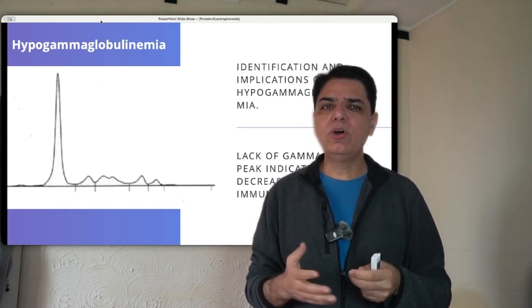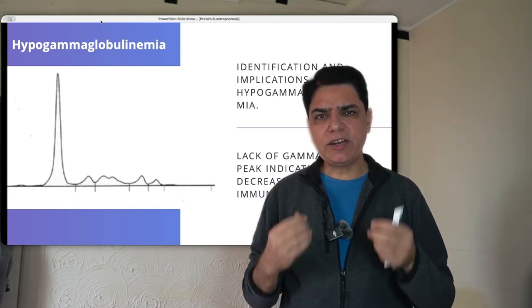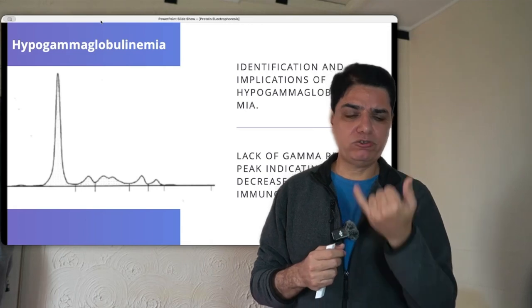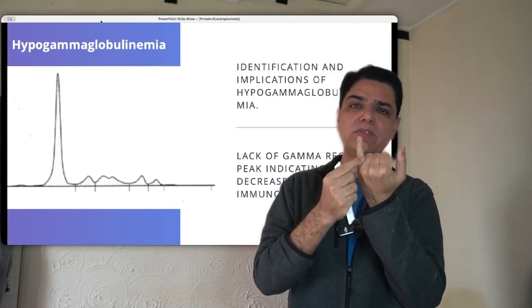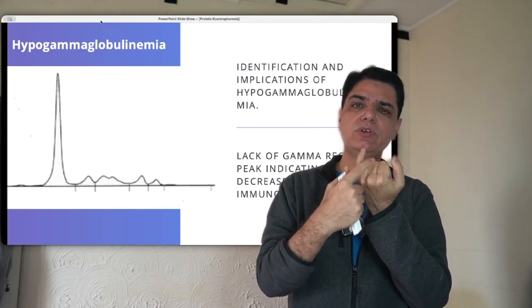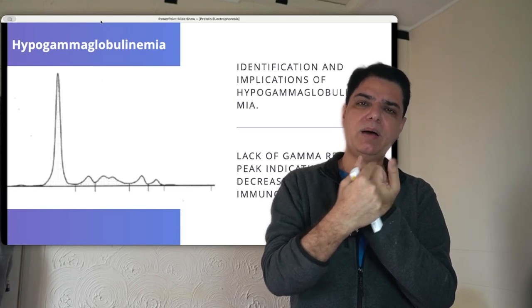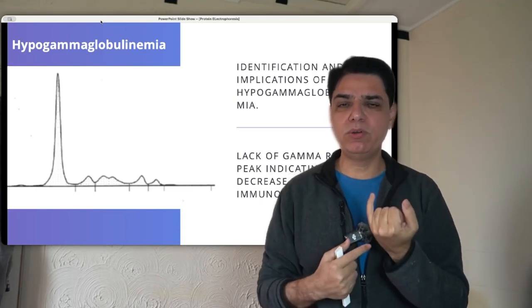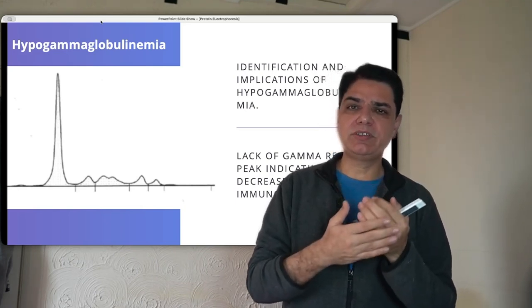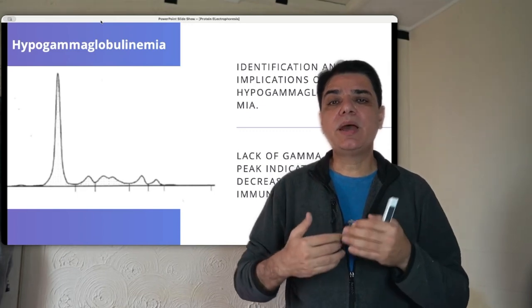So that is how you interpret the protein electrophoresis. So in a nutshell, again, you should know that the normal protein electrophoresis is in the form of this, where there is a normal spike of the albumin followed by 3 same-sized humps, alpha-1, alpha-2, beta globulin, and then this smaller but slightly bigger hump as compared to these three, which is known as the gamma globulin section. So again, if there are increases and decreases in these relevant sections of the alpha-1, alpha-2, beta, or gamma, they can indicate different types of diseases.